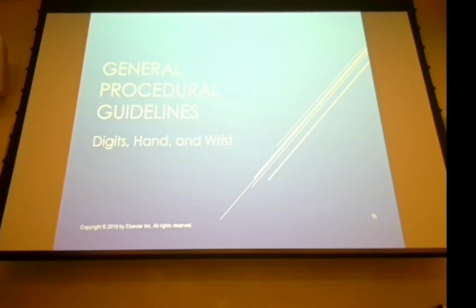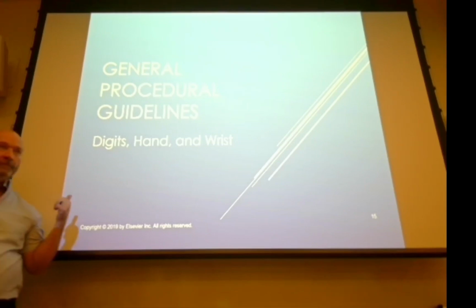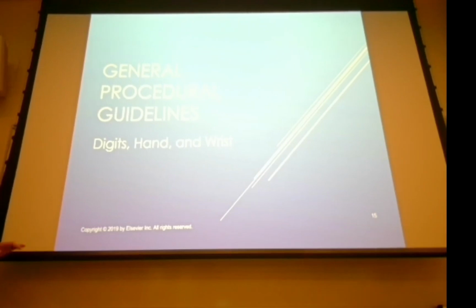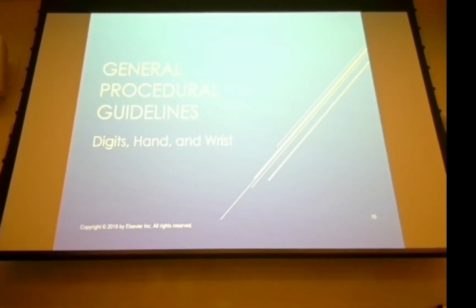You want to have that stuff on the image receptor: the patient's name or identification number or both, the date of the exam, the hospital or the facility, and you also want to make sure that you have your marker on it as well, the correct marker. Now, some of your hospitals are going to be very, very particular about where they want their marker. They want it on the lateral side, so that would be the thumb side. Thumb side's always going to be the lateral side. So they want it on the lateral side, a specific place, specific markers, oriented in a specific way. So you're going to have to make adjustments and learn what it is that the radiologist wants.